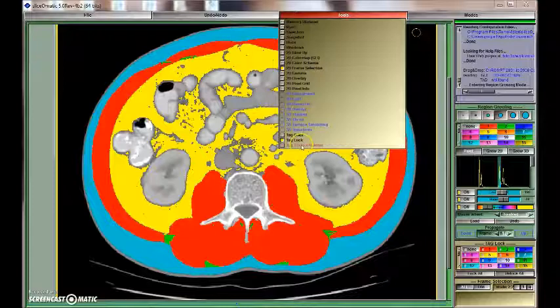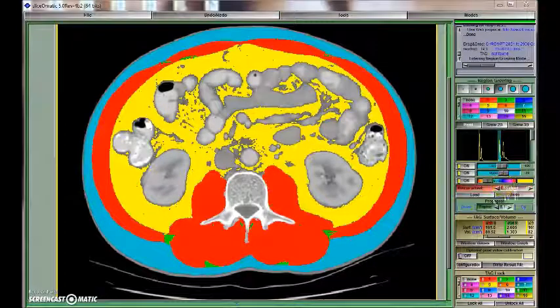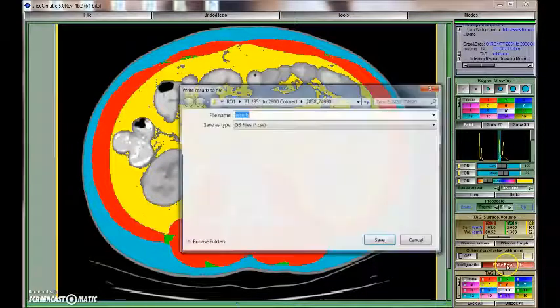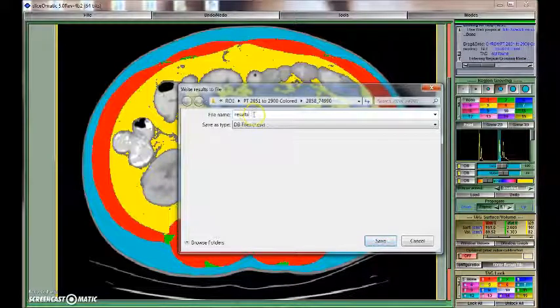The last step is to export the results using another software function. You can export the results to your computer and then proceed interpreting the data.